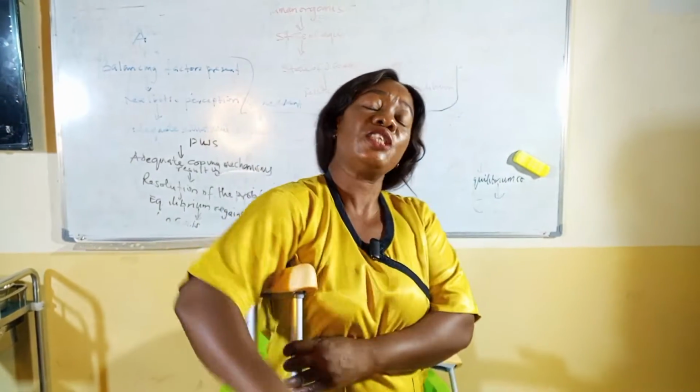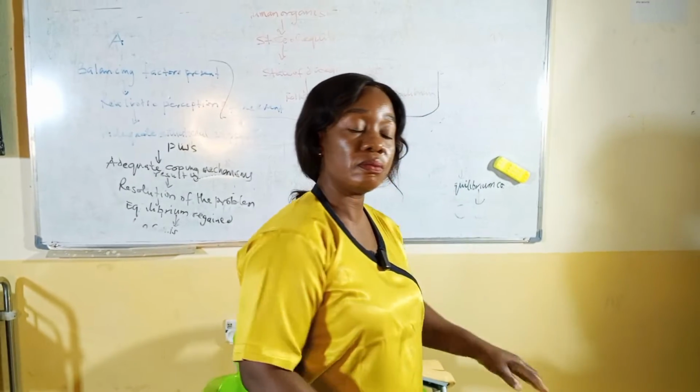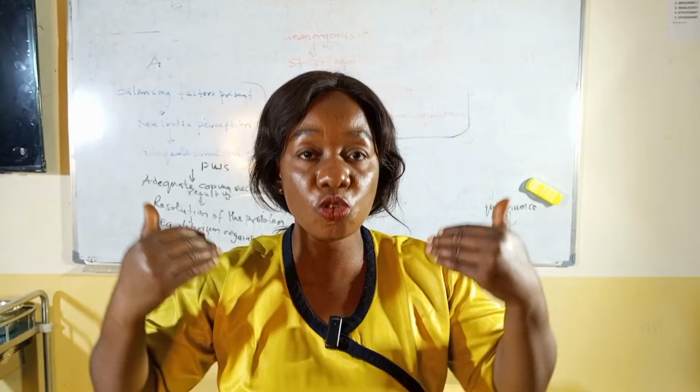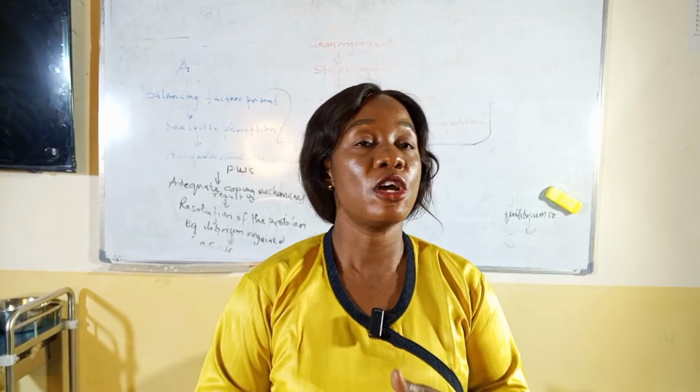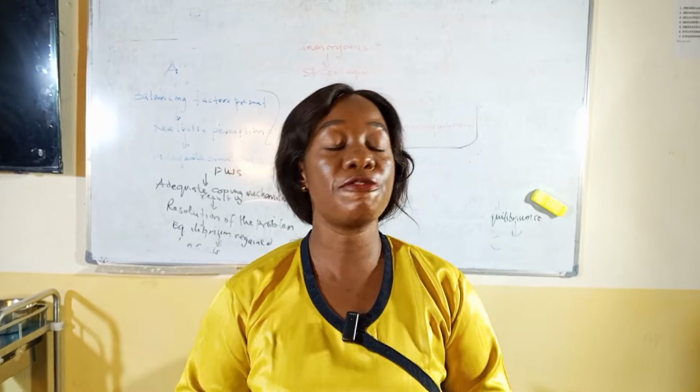So now the doctor will also prescribe the type of weight bearing that the patient should apply while walking. So we have non-weight bearing, partial weight bearing, and full weight bearing.